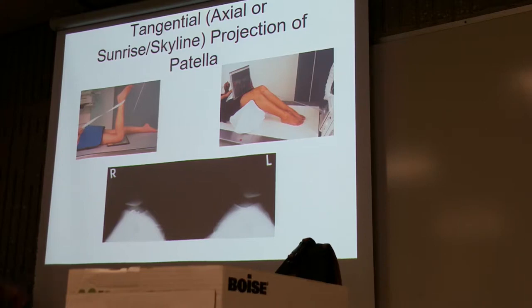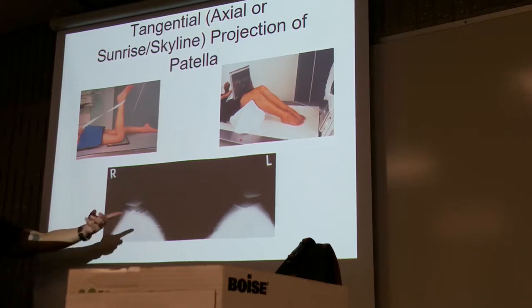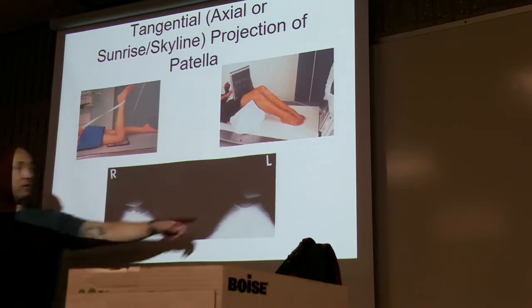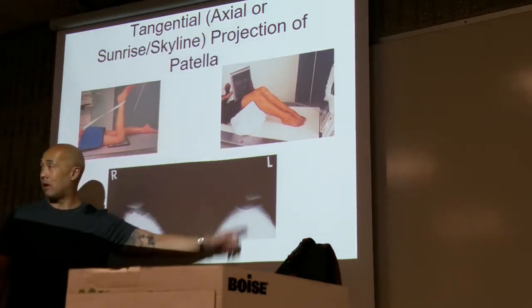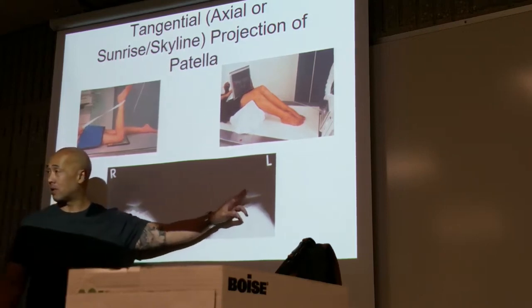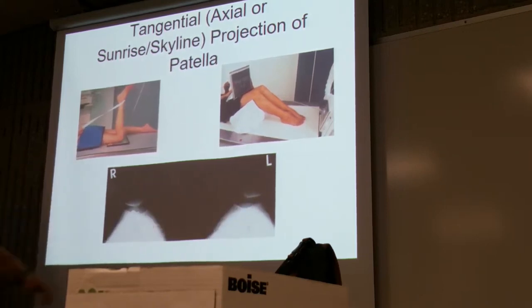You know why it's called sunrise, right? Doesn't it look like a sunrise off the mountain top? Which one, the right or the left one? They both do the same thing. I know, but just because one has a bigger space, is the left one out of place? This one right here? Yeah, this one's out of place. It should be right here in the middle. Oh, that's actually a good observation. It should be somewhere in the middle, but it's off to the side. So there might be some kind of pathology or condition going on with that.